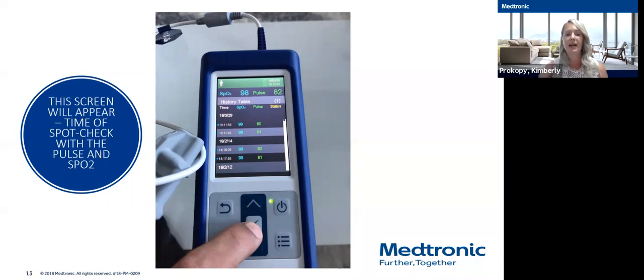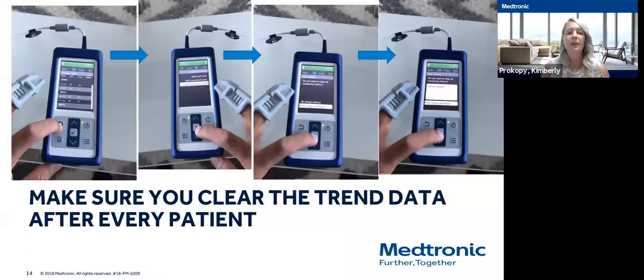You want to keep in mind that between patients, you want to make sure that you clear your data. So you're going to go to menu and go down to clear patient history and then select it. It will ask you to confirm, and you're going to confirm that you have cleared the history in between your patients. I know a lot of people tend to forget to do that, but it makes things less complicated for you, so you just want to clear the trend data in between each patient. Okay, any questions on that? I know that's probably fairly familiar for you guys.